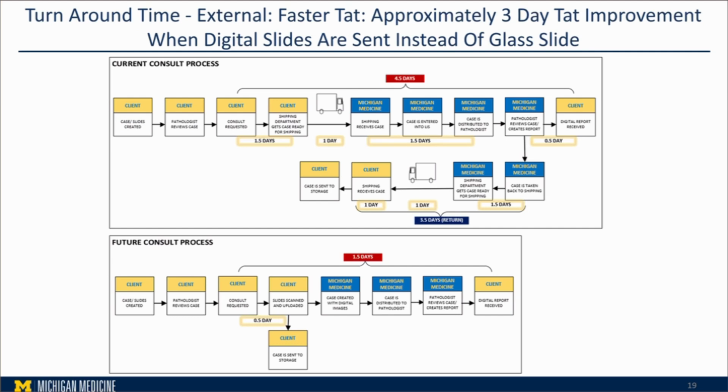consultation. For example, right now we receive all the glass slides from external consultation, and we have cases for true consultation and cases for transfer of care for those patients. This takes an ample amount of time, from opening the package, assignment, and distribution, until the case is signed out. This is just a proposal, and we showed that you might be able to cut this turnaround time, especially if there's an institution that is going to be digital.